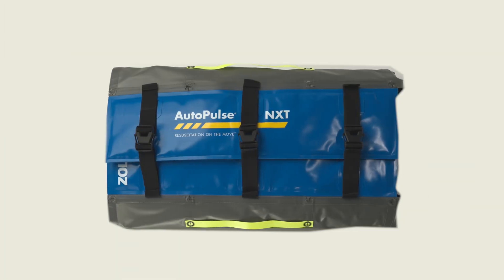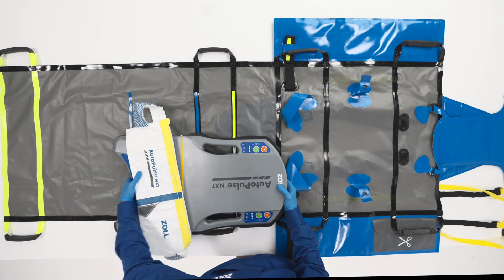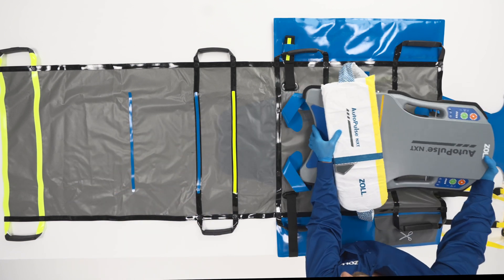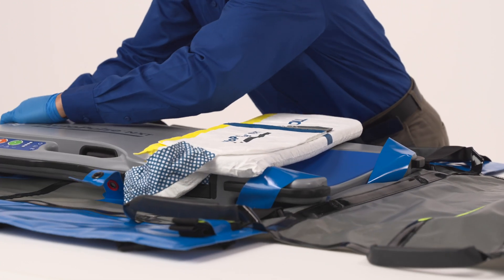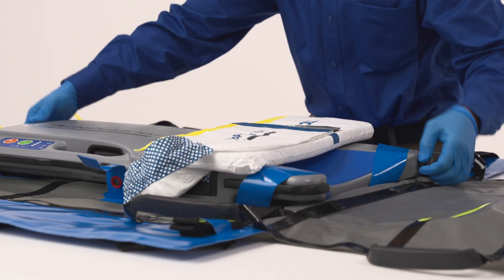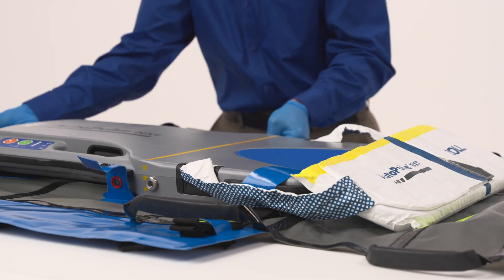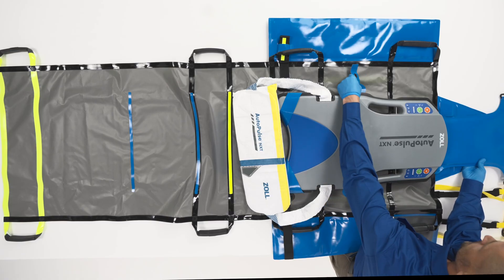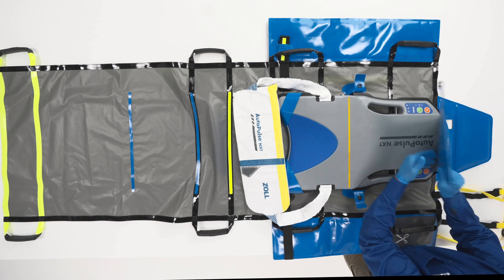The QuickCase Carry Sheet is designed to protect the platform during storage and to transport the platform and patient while the platform is in use. To attach the AutoPulse NXT platform to the QuickCase Carry Sheet, place the platform into the holding straps, ensuring the platform fits tightly. Secure the platform to the QuickCase Carry Sheet using two of the four straps on the platform wrap.